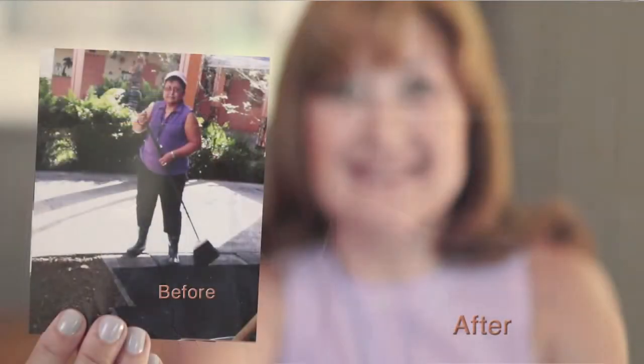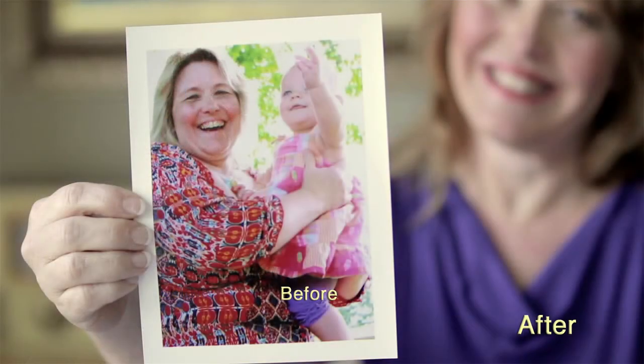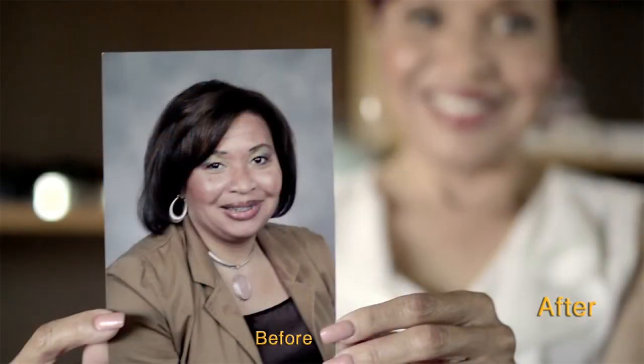Compared to other weight loss interventions such as the balloon, the POSE procedure is a permanent solution — the anchors and plications remain lifelong. From all the incisionless procedures currently available, POSE is the most effective one. It helps patients change their lifestyle through longer and earlier satiety, making it a smart approach to lasting weight management.